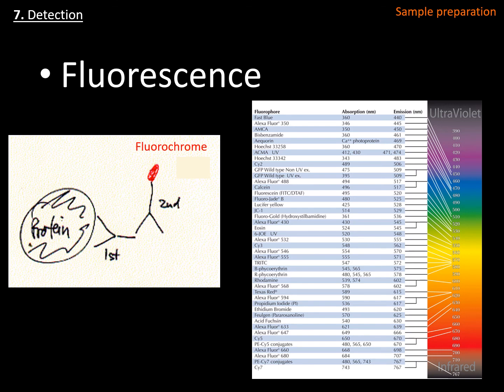Because of the existence of different fluorochromes, you can exploit all the capacity of detecting multiple targets in a sample. And because of the existence of so many, you have the entire spectrum of light in order to have different combinations, and you can have 3, 4, or even 5 different targets labeled in the same specimen.